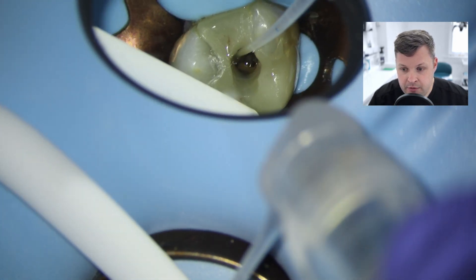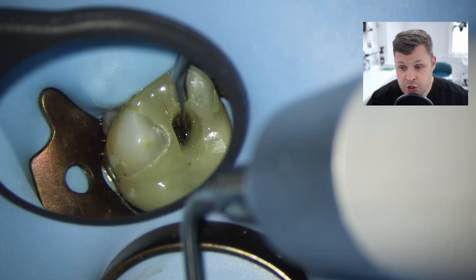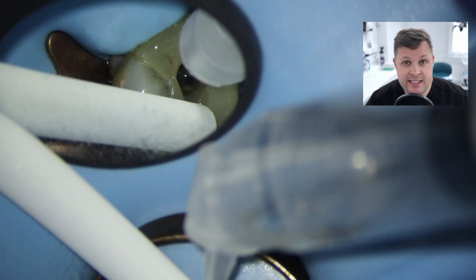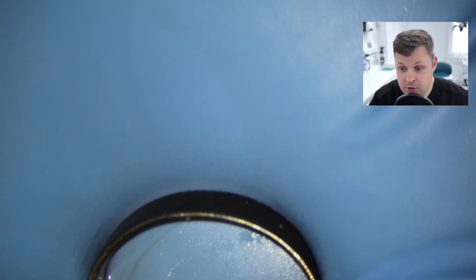Once we've ascertained there are only three canals, we're going to do our final irrigation process. We're using 17% EDTA and sodium hypochlorite, activated with an ultrasonic activator. Then we're ready for obturation.